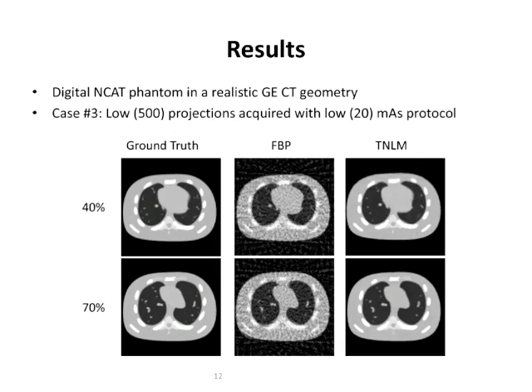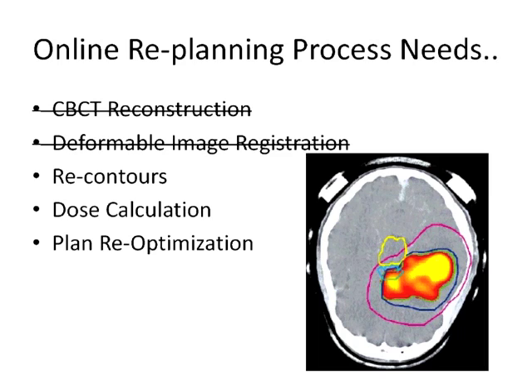Okay. Using that formula, this is the ground truth of the reconstruction, and this is a poor result from the method that we used before because we were so limited in time. Now, using the new algorithm and this GPU parallelization, we made an output almost close to the ground truth in quite a realistic time.